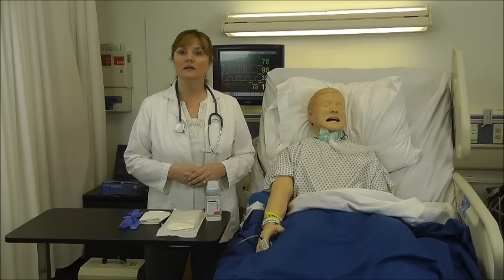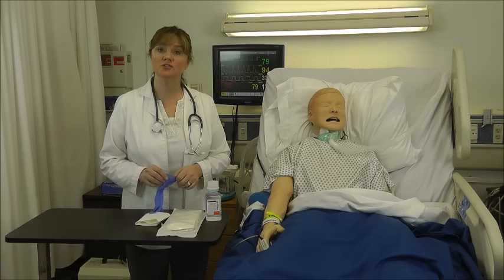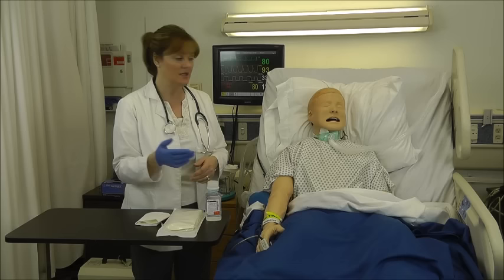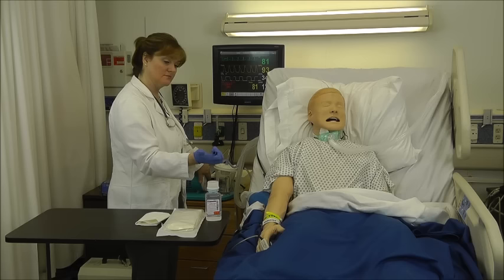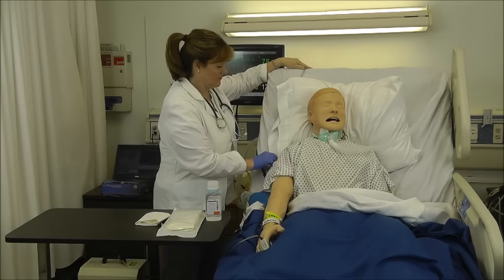Now that I've done my pre-respiratory assessment, I'm going to set up my equipment, but first I need to test the suction. I have a portable unit. In the hospital setting, you'll be using wall units, and that setting should be set to 100 to 120. I'll don my clean glove, because the end of this tubing is dirty and I don't want to get my hand dirty. And I'll turn on the suction and occlude the end and verify that I do have suction. I'll set this nearby and remove this glove by putting my finger under the glove and removing. I'll leave the suction running while I set up my supplies.